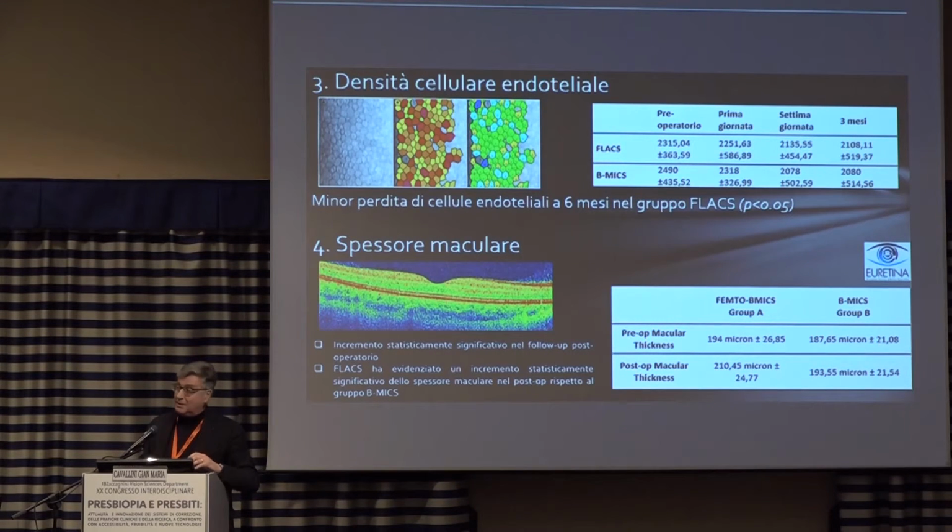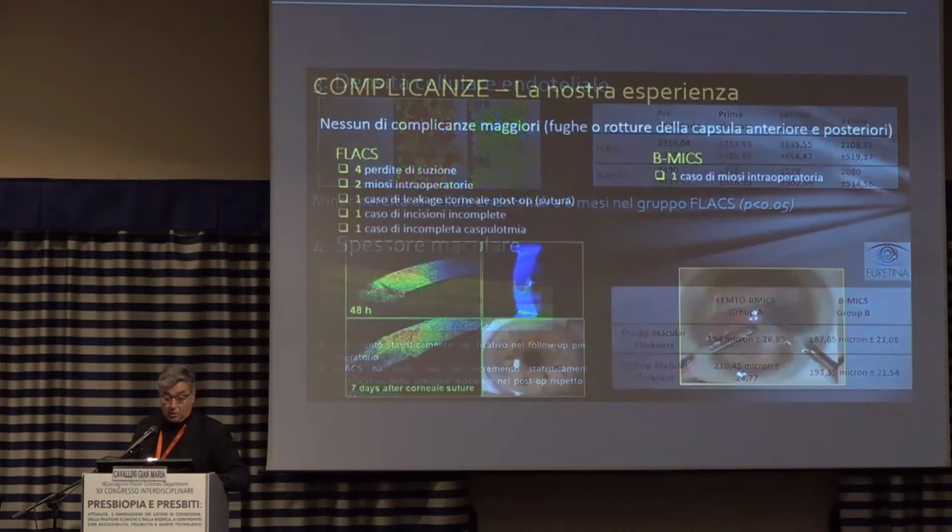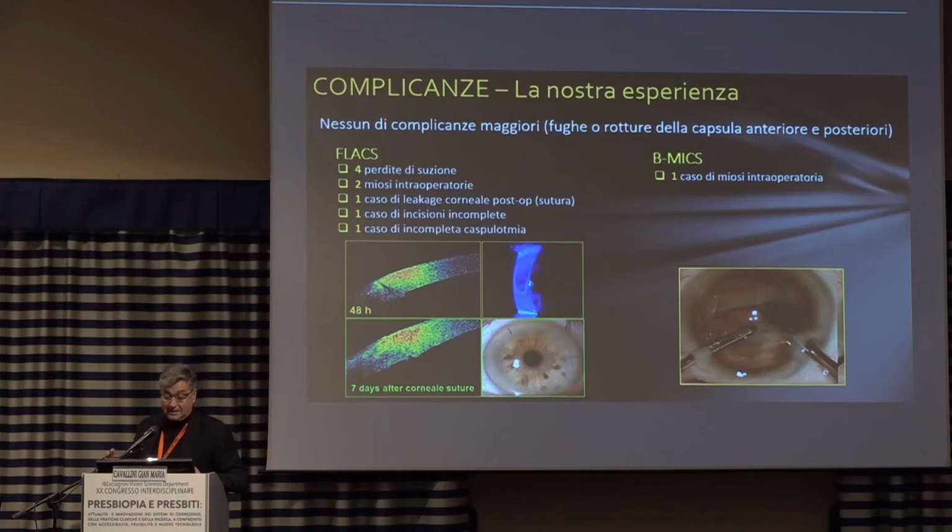We had no cystoid macular edema or similar alterations, yet we found that there is a tendency to the macula showing greater thickness after surgery. I've had no severe complications.